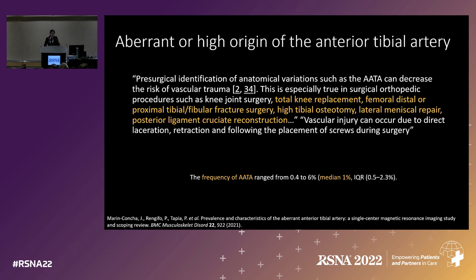And of course, you actually don't have to see this on MRI, right? You can get it on your CTA that's for another purpose. You can do it with contrast CT where you're looking for abscess and the like, or for tumor. So if you see this one, though, let them know.